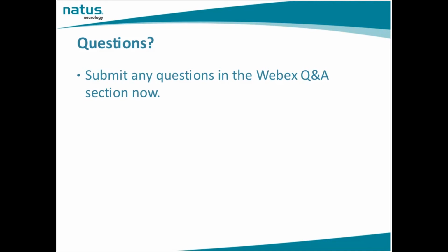This is probably the last question we'll take, and then we'll do our wrap-up here. You mentioned performing a baseline TCD in the prep room. What do you do if you can't find a window? How have you handled that, Donna Lee? You just don't do it. And, Katie, I will not, and I did this for years. I tried to use that posterior window, the one right in front of the ear, because it's the only window I had.